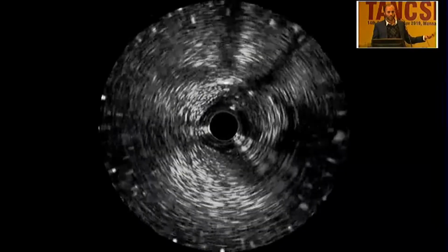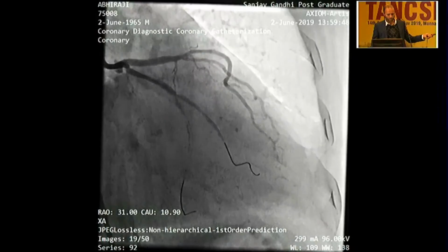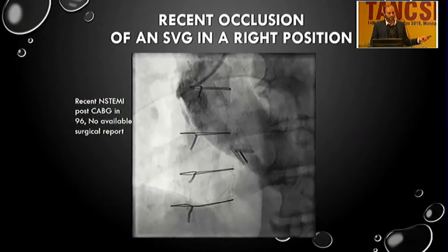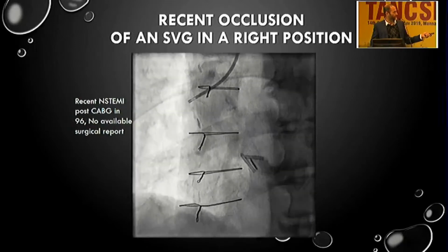In the interest of time, I'm going to kind of skip all this stuff. This is post-stent. Time for one more case. All right, this is kind of a fun case. So this was an occlusion of a SVG.